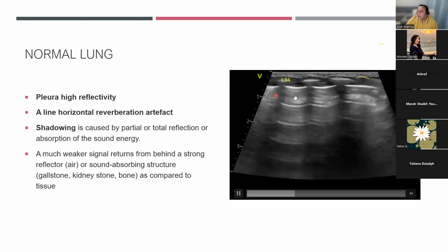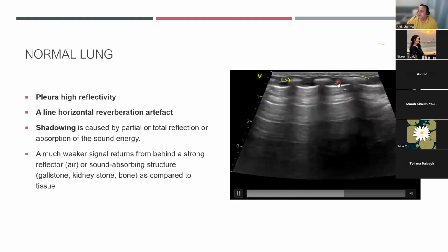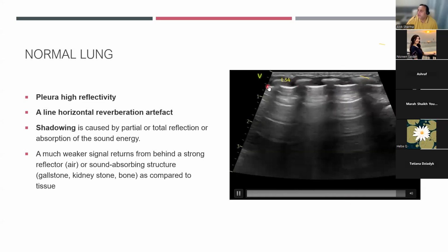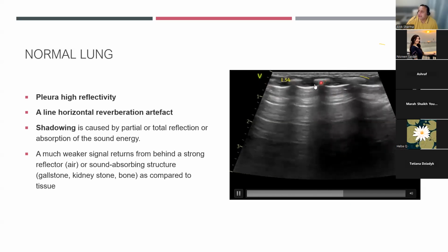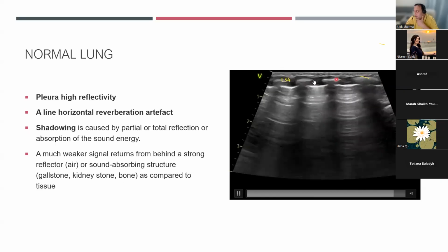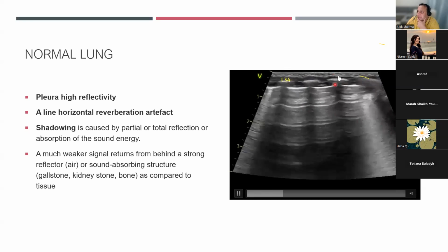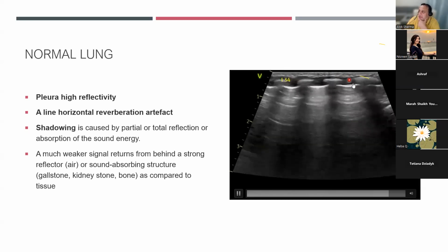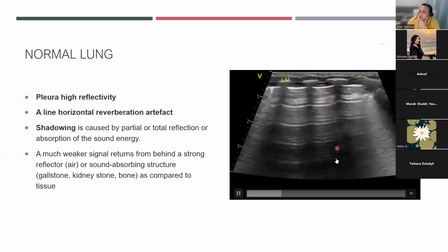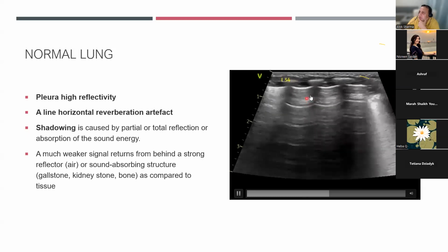Spotlight. So this white area here, these are ribs, and this is an intercostal space. So I can see one, two, three, a fourth rib, about four ribs, and I can see one, two, three, four intercostal spaces. Now, like I said to you, reflectivity and difference in acoustic impedance means there'll be maximum reflection across the rib, which means you're going to get this area of darkness behind the rib. This is dropout. And this basically is an area that you're not going to be able to get tissue interpretation of.